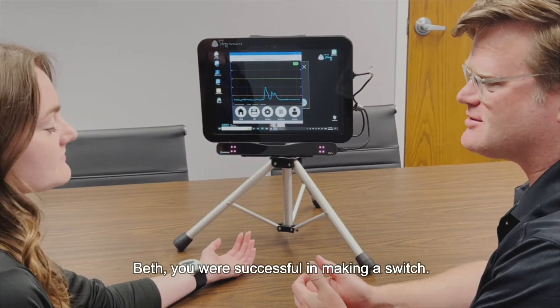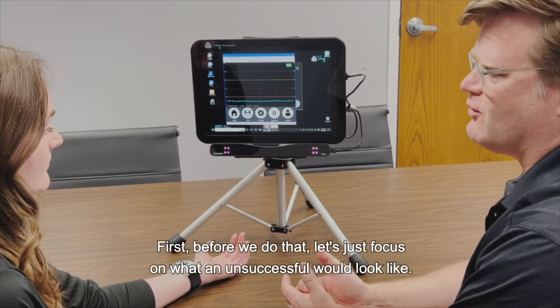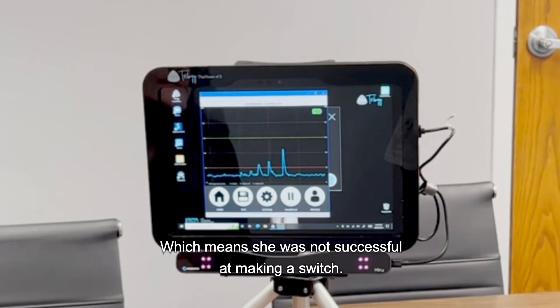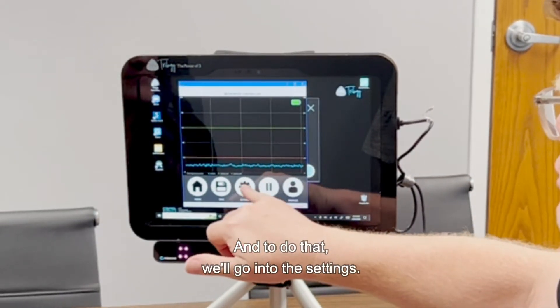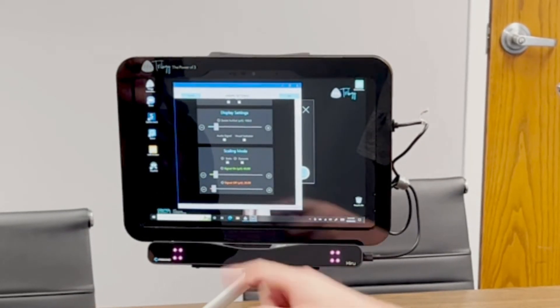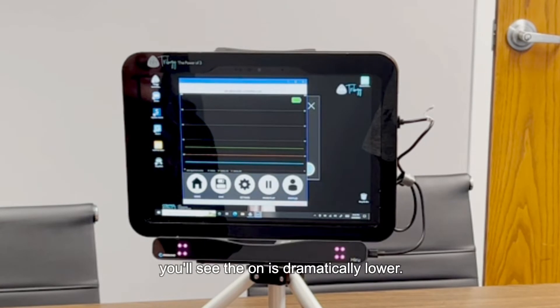Beth, you were successful at making a switch. But what if you weren't successful? What are some changes we could make to help? Let's show what an unsuccessful attempt would look like. You can see here two or three lines where Beth was over the red but not over the green, which means she was not successful at making a switch. We need to bring that green line lower. To do that, we'll go into the settings, scroll down to scaling mode, and come to the signal indicator — which is in green, which is helpful because that's the color of the line we need to move down. By hitting the negative, we lower that line. We're going to try to get it about half the distance where we were, then hit okay.